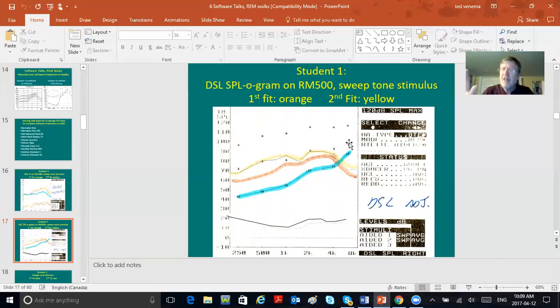Anyway, be that as it may, on the software, when the hearing loss was entered into NOAH, the hearing aid manufacturer got chosen. DSL4 got chosen as your fitting method. Hit the button, quick fit. Okay, boom. Yep, looks like the hearing aid response is right on DSL4 targets.